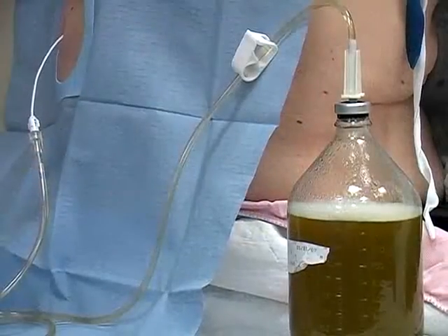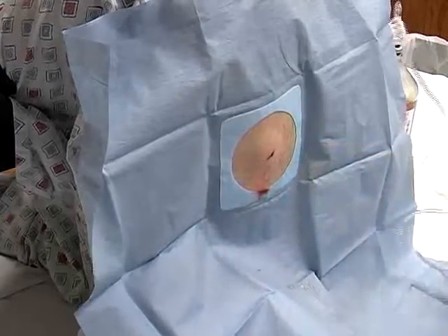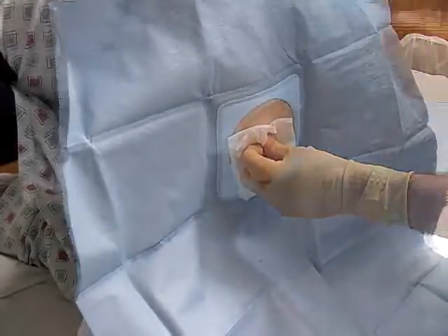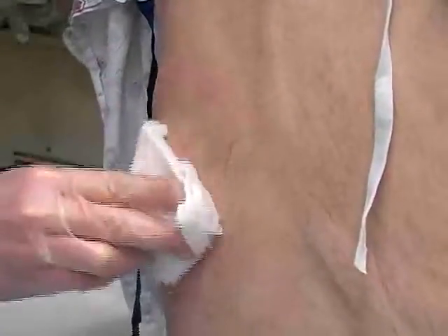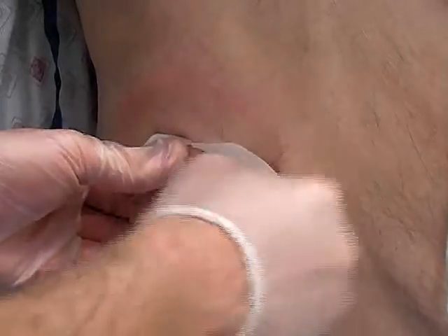Once the drainage of pleural fluid is complete, remove the catheter from the patient at end exhalation. Remove the sterile drape, wash away any remaining skin cleansing agent, and apply a sterile occlusive dressing over the needle entry site.